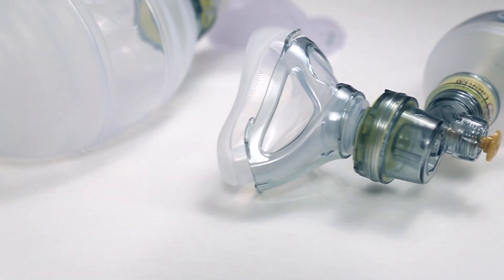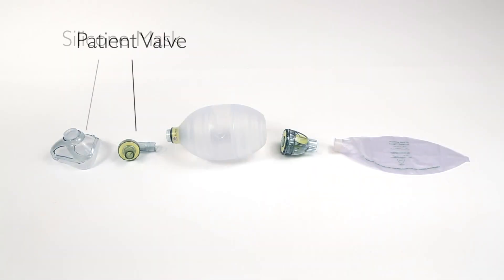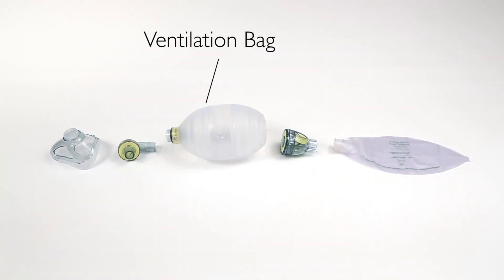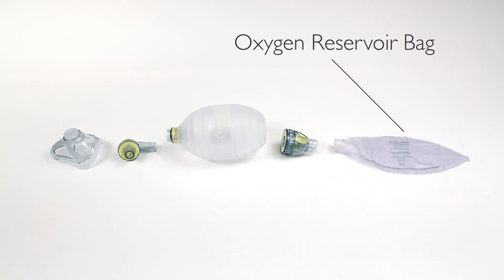The LSR consists of five main parts: the silicon mask, patient valve, ventilation bag, intake and reservoir valve, and oxygen reservoir bag.